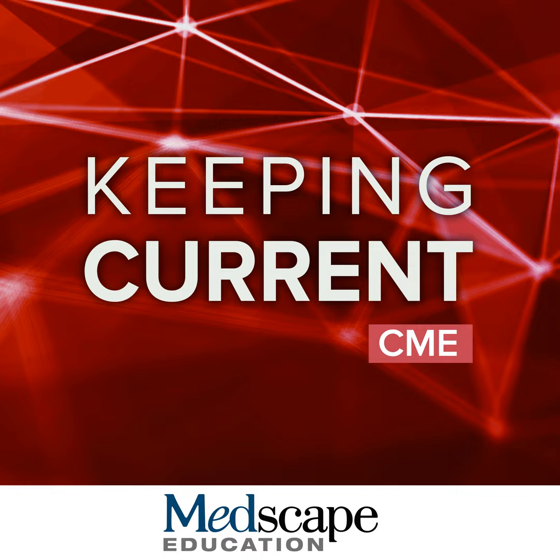If we look at hepatocarcinogenesis, we start with regenerative nodule and over time get to progressed HCC. Notice that the neoarterialization, that hallmark of arterial phase hyperenhancement, really starts to develop at the level of small progressed HCC.